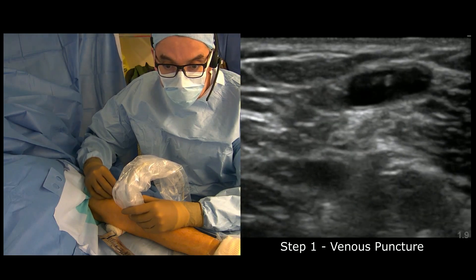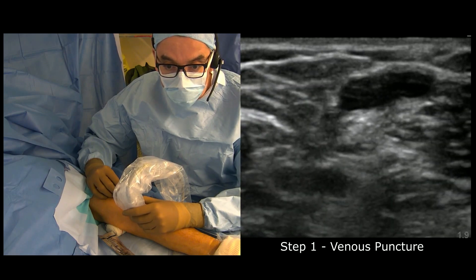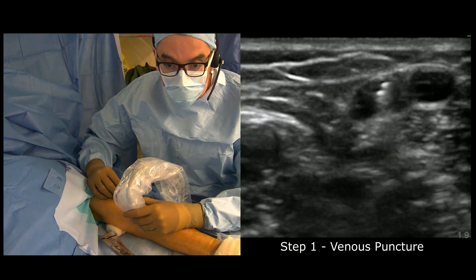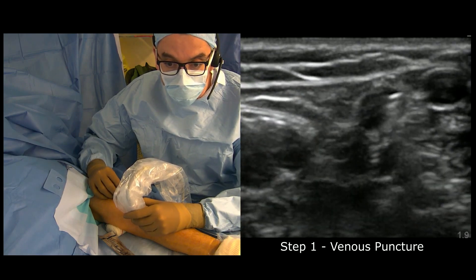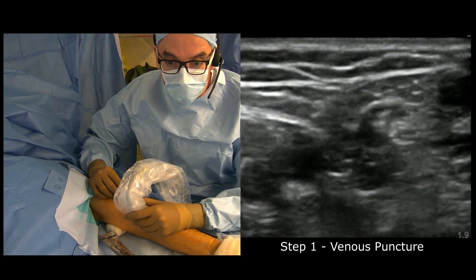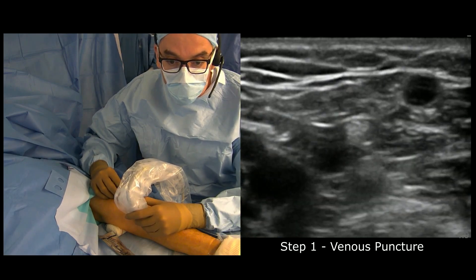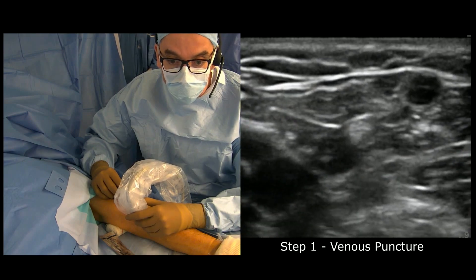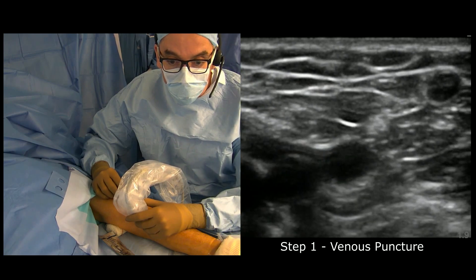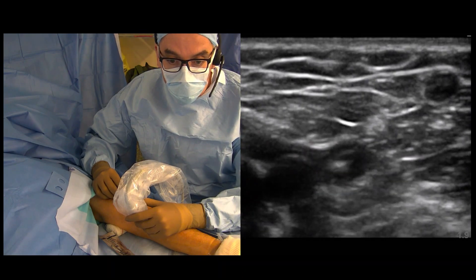The needle tip is already into the vein, and then I will move slowly down. Imagine this as a CT scan with the ultrasound probe going down and following the echogenic needle tip. I'm tracking the needle down, making sure that the tip of the needle stays always in the middle of my screen so I don't touch the vessel wall, don't cause any perforation or hematoma, and I'm not going to trigger any spasm.